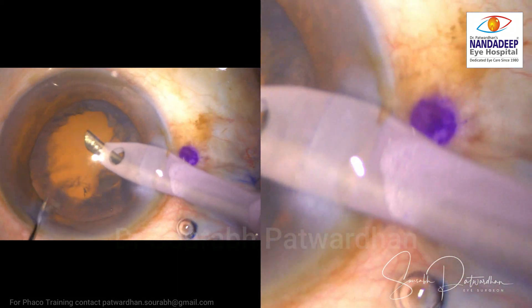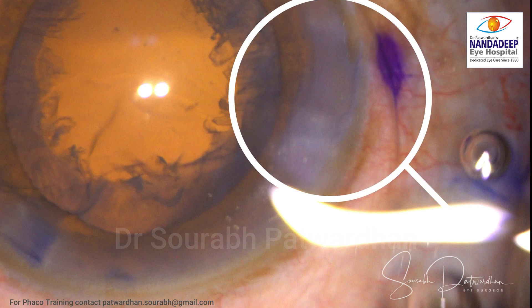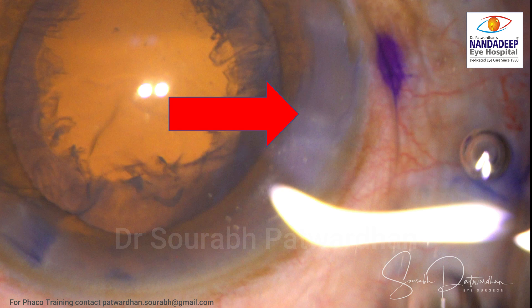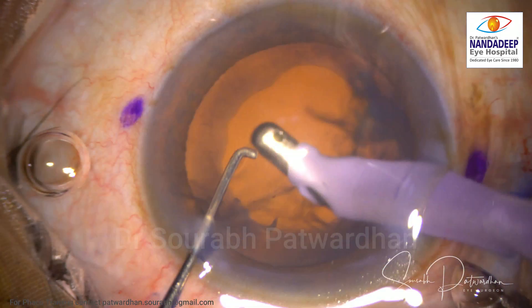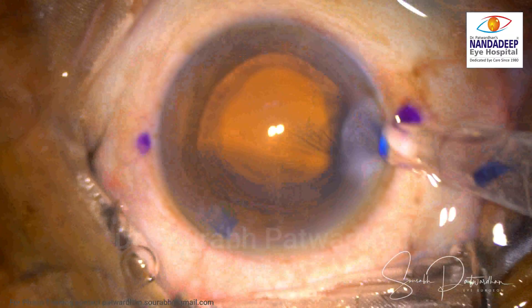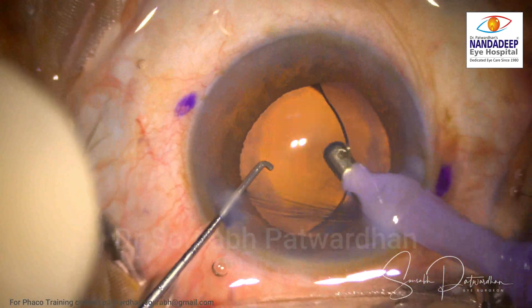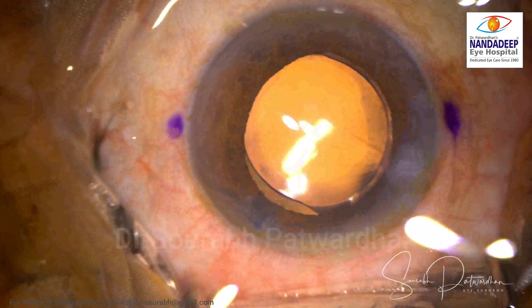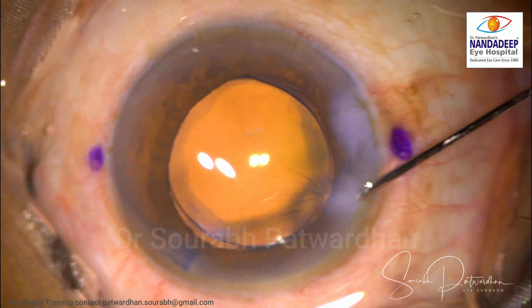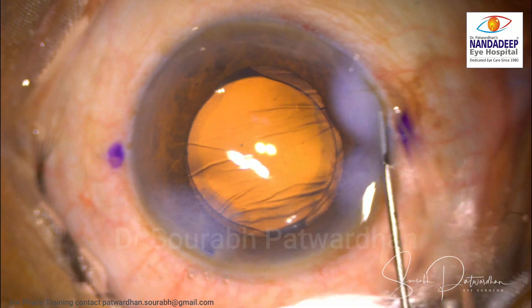For quadrant removal I am using a combination of torsional with longitudinal phaco, and I use the same settings for all hard grade cataracts. As the phaco is being delivered, you can notice a little bit of whitening occurring where the phaco needle is very closely associated with the corneal incision — very subtle, and never noticed during this surgery. That's the end of the phaco, a very quick surgery, and you can see just inside the edge of the incision a whitish area — that is the area of corneal burn.